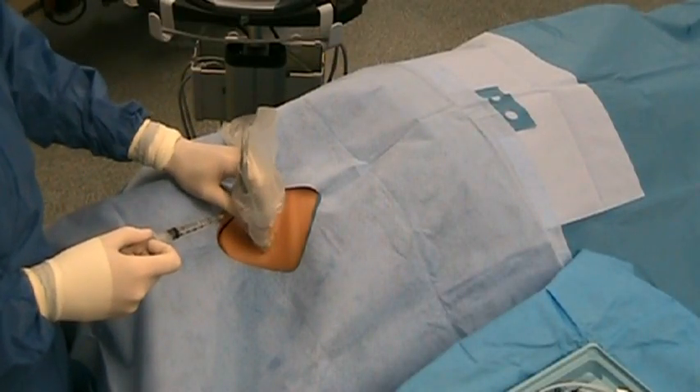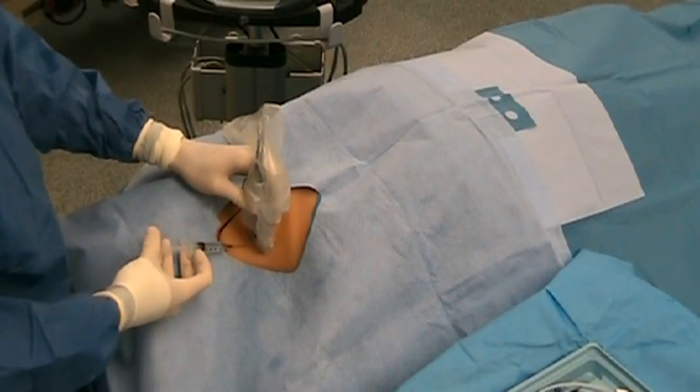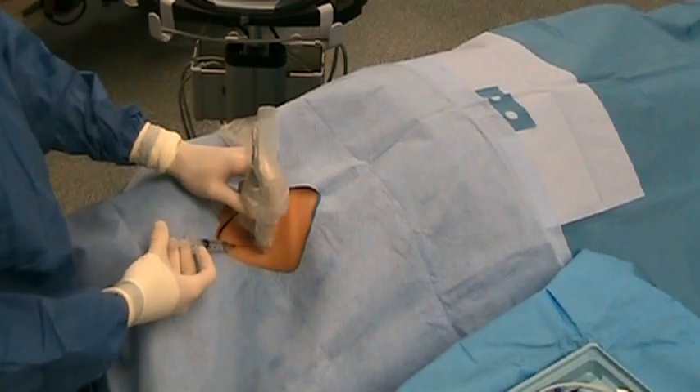The site of skin insertion is determined by the ultrasound. Lidocaine is injected from the skin surface down to the jugular vein.